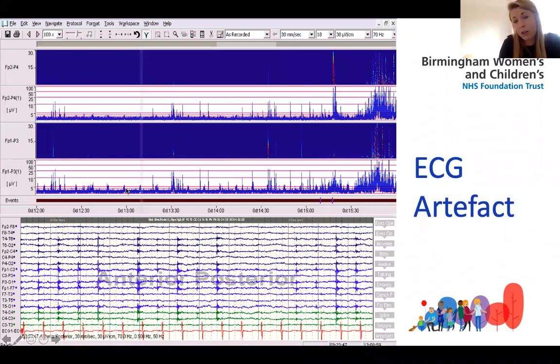This happens a lot in our patients, particularly remember that the amplitude of your ECG is much greater than your cortical amplitude. And so particularly in patients that have overall suppressed cortical activity, you can get a lot of artifact coming from the ECG itself. So again, here you can see lots of very small, granted because it's overall low level artifact coming in from your ECG, spikes, spikes and spikes. But you can see that that correlates with every QRS complex that you're getting from your ECG.